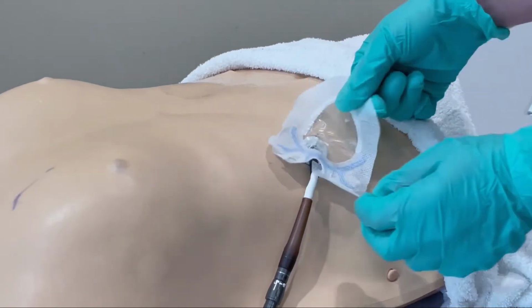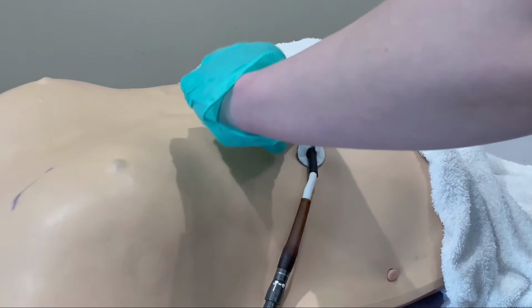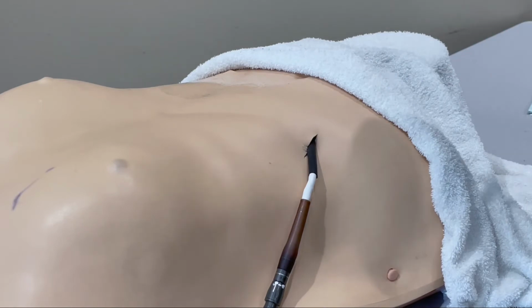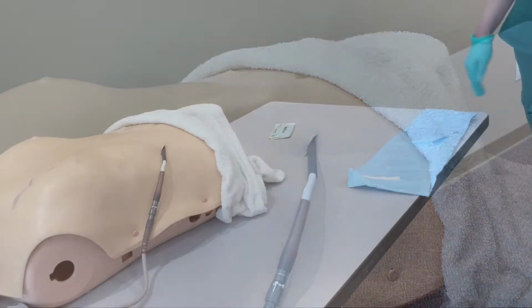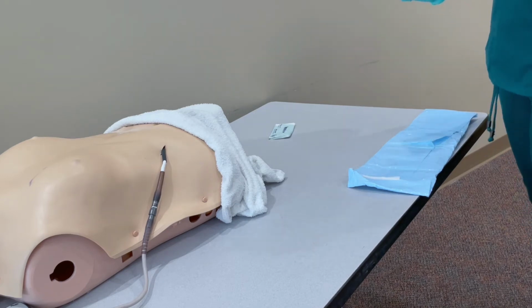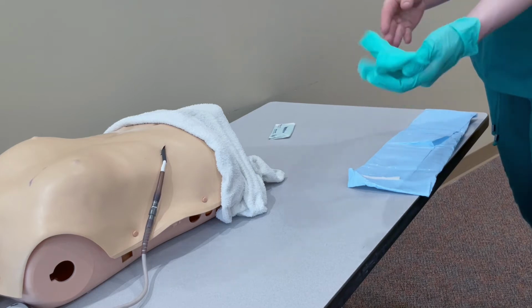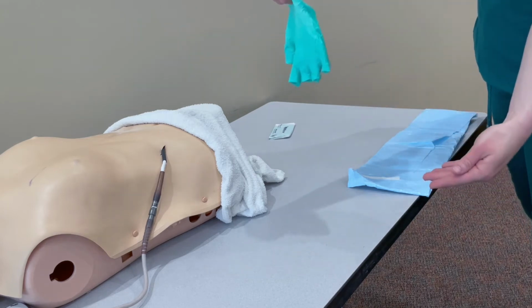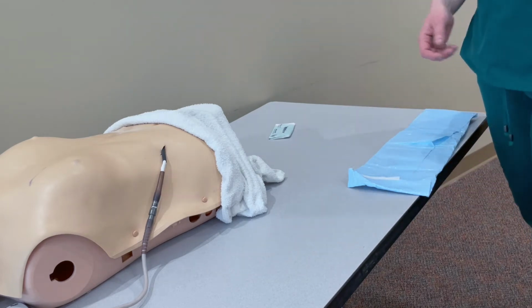This disc, if it does not come off naturally with the dressing, you can just reach in and pull it off. And then you want to always visualize the site. Make sure there's no redness or drainage. If there's anything new or it looks irritated or different, go ahead and have your family member take a picture of it. So that way you can send a picture to your LVAD team and then give them a call. So now that we've removed the old dressing, we've examined the site for any signs of infection. I'm going to go ahead and remove my clean gloves. You can remove these, keeping the contaminants in by reaching your finger inside the glove and pulling it inside out and then throwing those away.